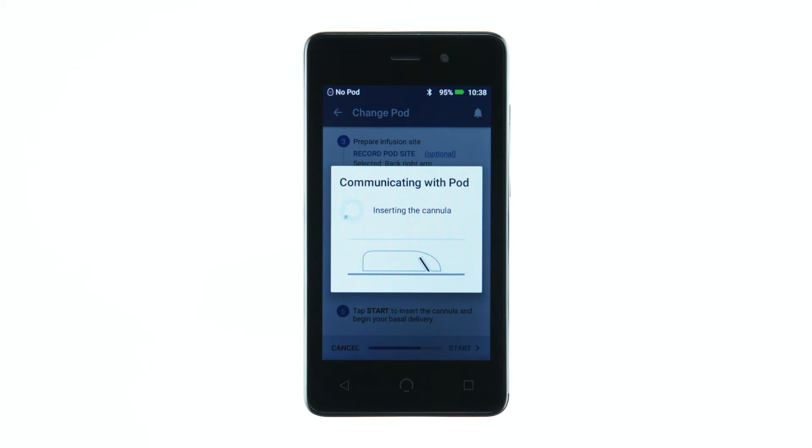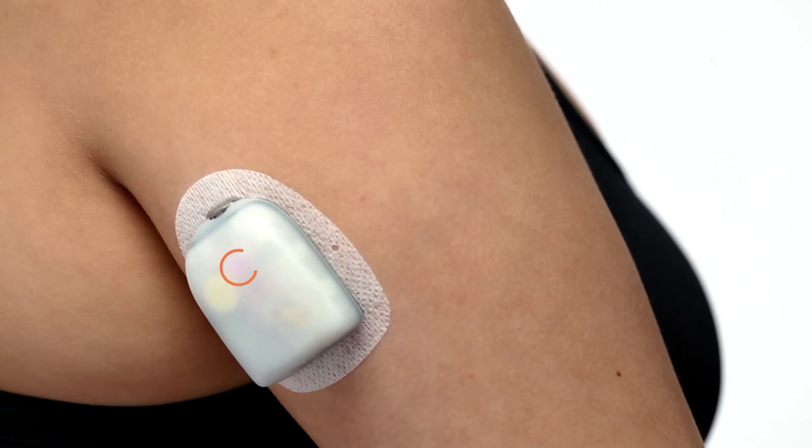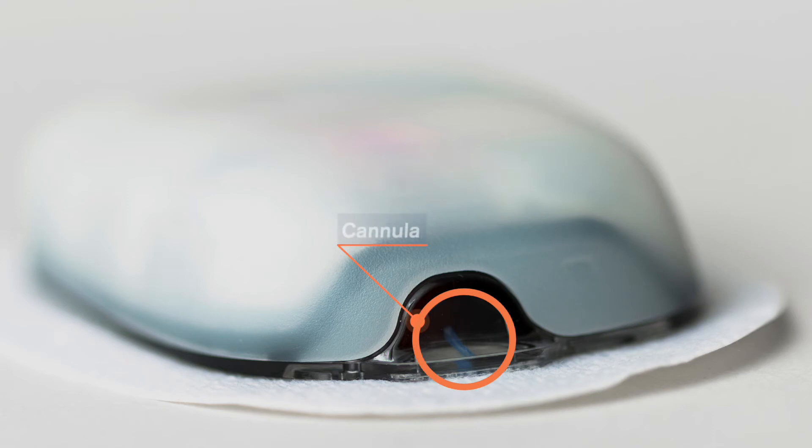The PDM now asks you to verify that the cannula was inserted properly. Check by looking on the surface of the pod for the pink slide insert. A light pink square above the viewing window indicates that the cannula was inserted. You can also look for the light blue tinted cannula in the viewing window.